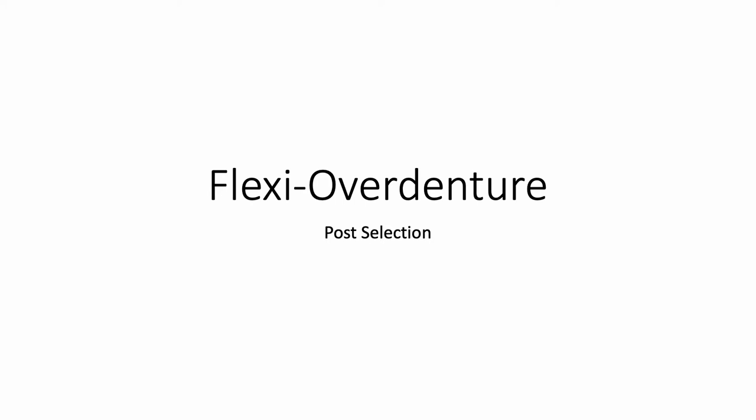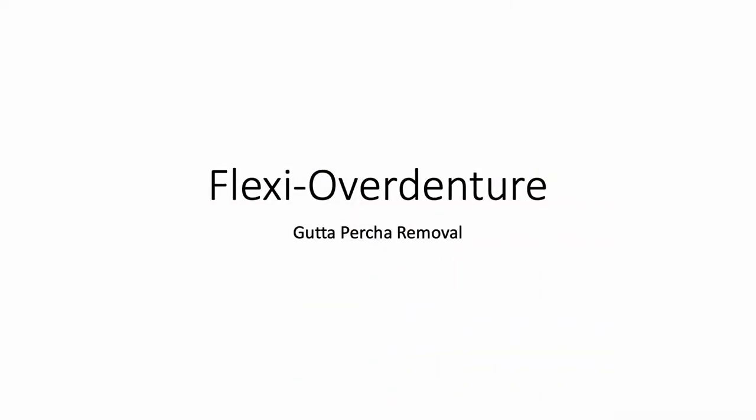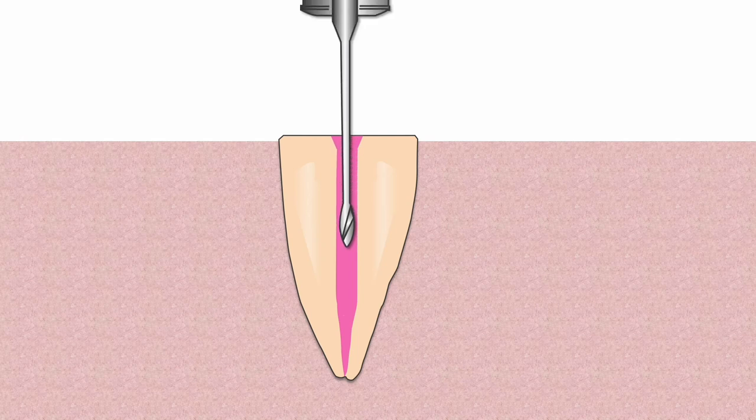The simple technique starts with post selection. Post sizing begins by making sure there is at least 1 mm of tooth structure lateral to the most apical placement of the post. The post hole preparation begins with the removal of the root filling material using either a Piso or Gates Glidden Reamer.